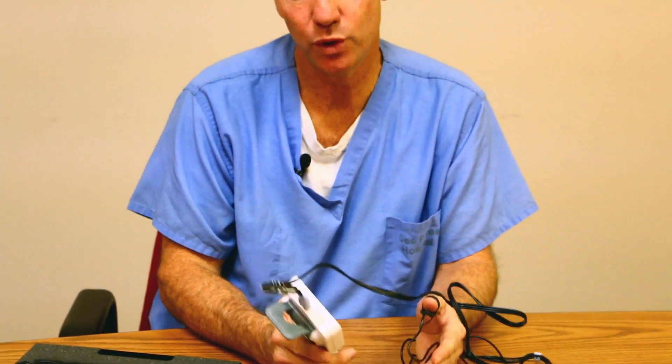The Stimpod is a new nerve stimulator that gives you the monitoring capability of tracking, monitoring, and documenting your train of four stimulations. Rather than just observing a qualitative or subjective effect of train of four, you are now able to connect your electrodes along with an adapter piece that basically fits on quickly to your thumb. Then I'm able to press the train of four stimulation and get the reaction.